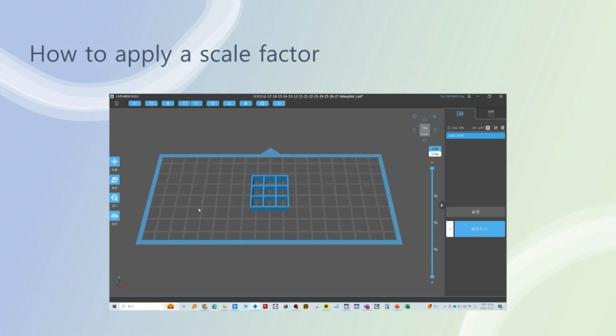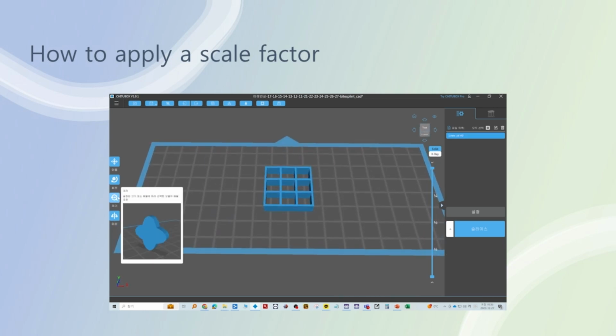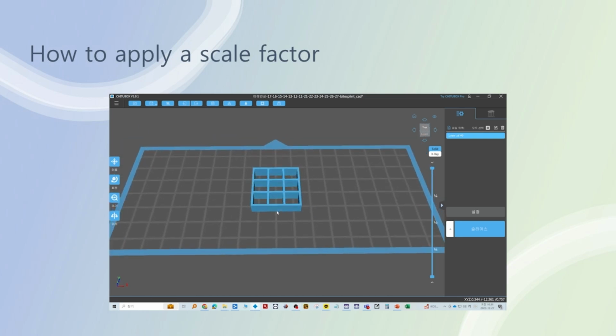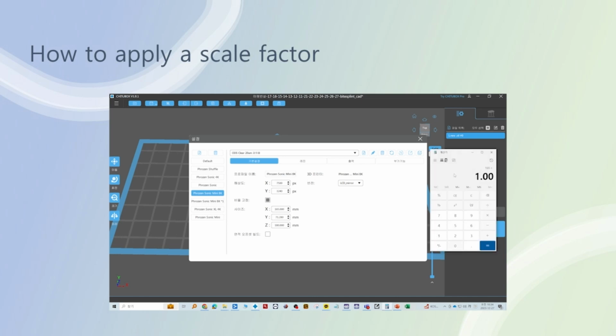We'll discuss the effective scaling to start with in 3D printing. Given that all resins shrink, it's more efficient to start with a scale slightly higher than 1.000, such as 1.007. There are various ways to apply scaling in slicing software. The first method is to modify the scale of the print directly. However, this is not recommended as it requires adjustments for every print.